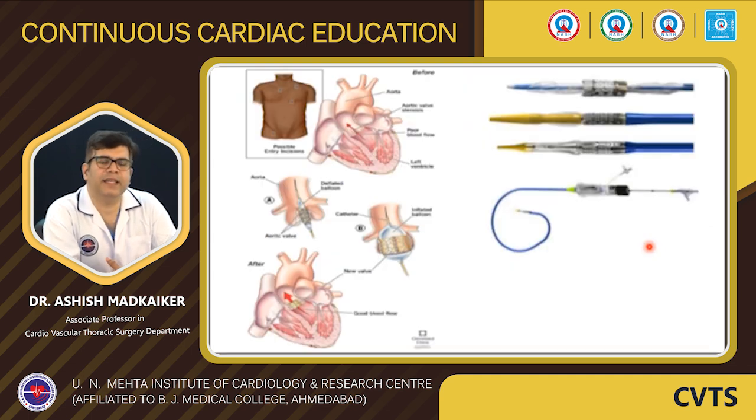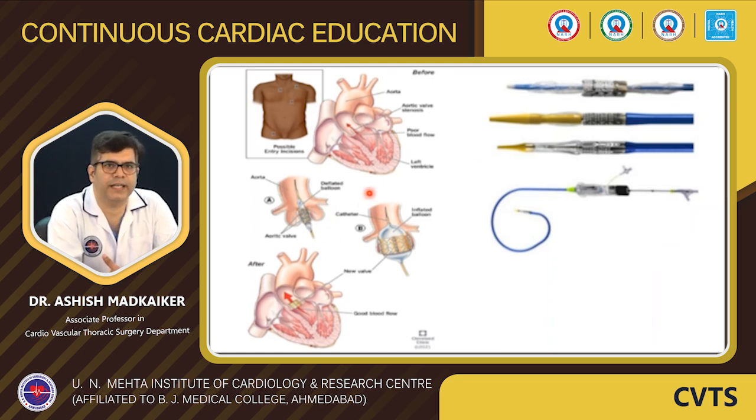So if we quickly see, I am going to simplify this procedure just for understanding. It is a very complex procedure and takes a lot of steps and a lot of understanding about anatomy and a thorough knowledge of TOE and cath projections. But we will simplify it for our understanding. We need to decide on what approach we are going to follow. Our main aim is to get the guide wires and the working wires into the LV and be in proper position, confirmed with multiple cath views and TOE.